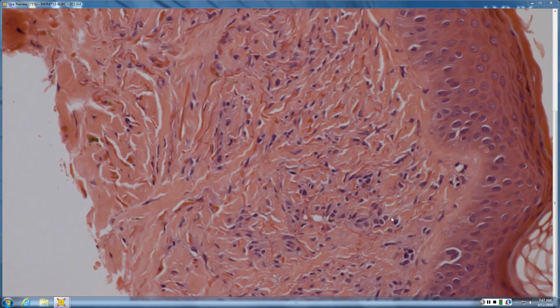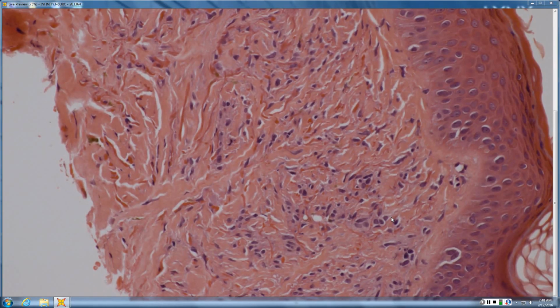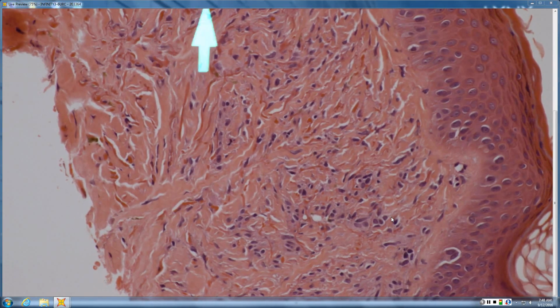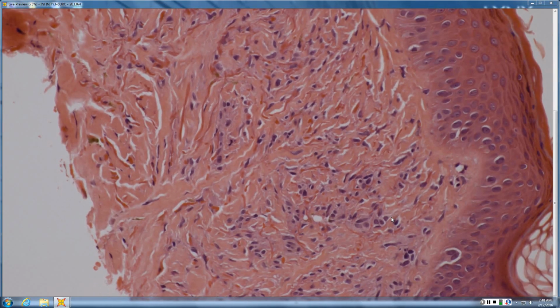One of the other stains that's very helpful to us is elastic stain. With the exception of desmoplastic melanomas and a few others, the vast majority of melanomas push everything out of the way to include elastic tissue, whereas in nevi, all the elastic is retained. In this case, our H&E stain picks up the elastic beautifully, so we don't even need an elastic stain. We can see it's retained all through. That's very strong evidence that this is a benign nevus.